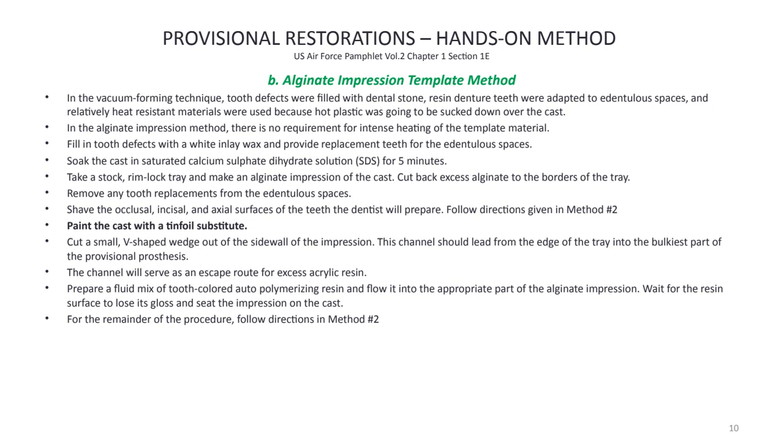This method is relatively fast way to do a provisional restoration. But it's usually done especially for patients that, let's say, had a tissue graft, and usually during the tissue graft procedure, the oral surgeon cuts a little piece of the gum from the patient's palate, and places it where necessary around the implant area.